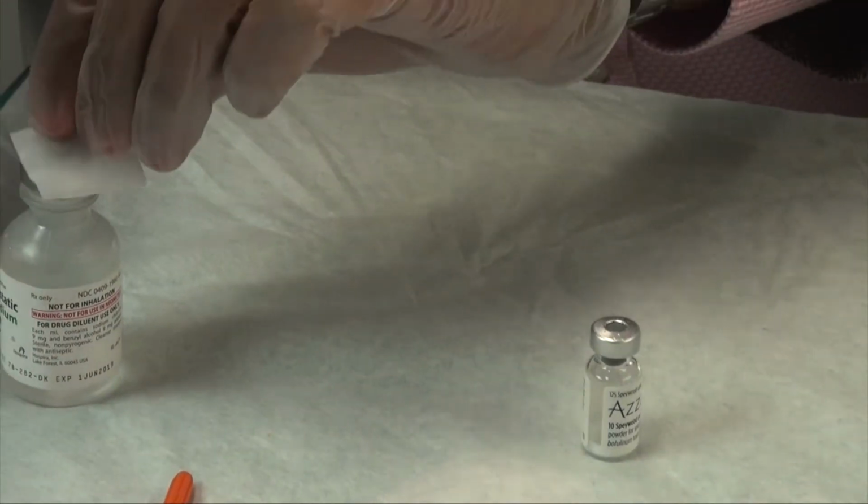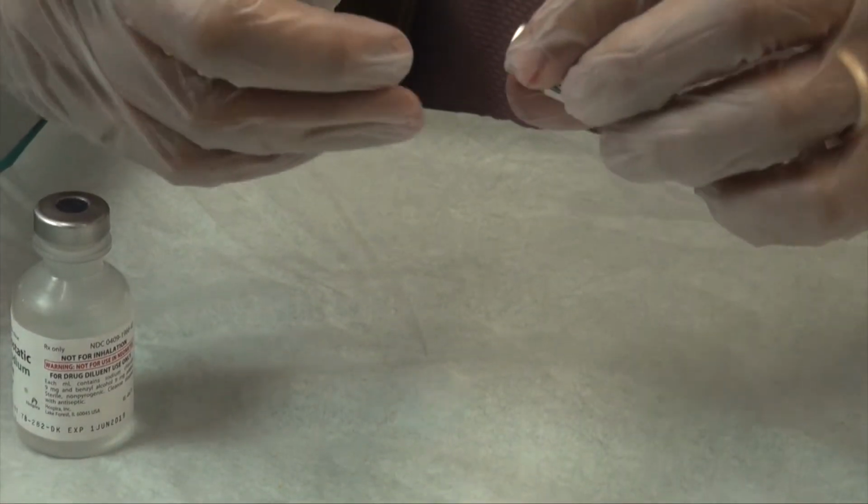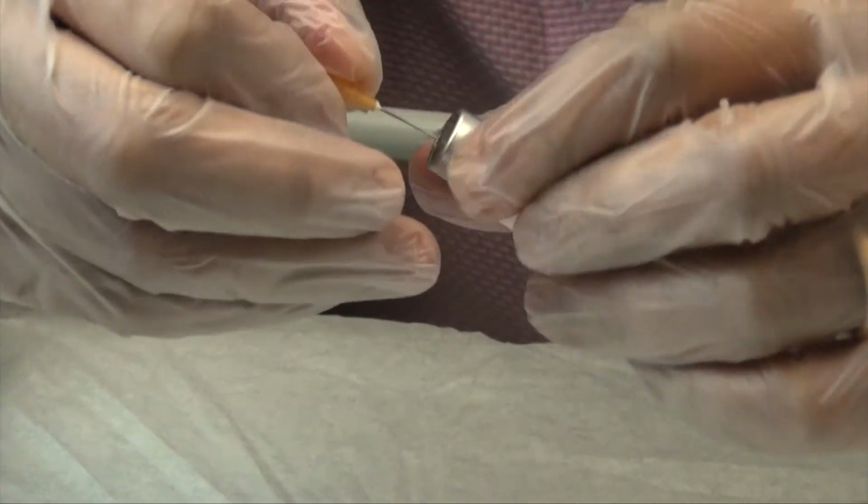If we uncap the vial, this time due to the smaller size of the vial, I use a 25 gauge needle, and likewise the isopropyl alcohol is used to clean the top of the vial and the top of the bacteriostatic vial. Once again, we perform our exercise of pressure release. Smaller hiss, obviously, due to the smaller needle and the smaller bottle.